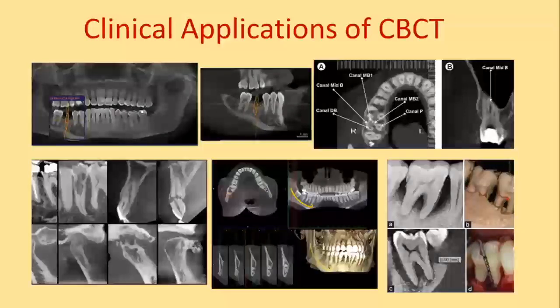I'll look at some case scenarios a little later, but a little emphasis, maybe about 3-4 odd minutes, on implants. Otherwise, the applications are pretty much the same. You're just looking at bone loss, you're looking at fractures, so just the application would change. A little bit on implants, because trust me, for an oral medicine person, implants just don't interest us, it's like measuring a lot of things. Maybe a prosthodontist would love this information, a surgeon would love it, a periodontist would love it, but a maxillofacial radiologist just hates to report implants because it's a lot of measurements. And honestly, we don't have any fun doing it.